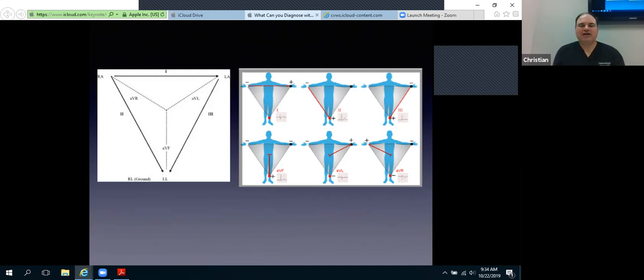So now, if your right hand is negative and your left hand is positive, and the strike is left-handed going to the positive, what direction should the signal move? Should be moving towards that direction, right? So as long as it's moving that direction towards the positive, it's going to have a positive deflection. And lead 1 will have an upgoing R wave, because that's where the majority of the ventricle is contracted during that time, right? So there's that.